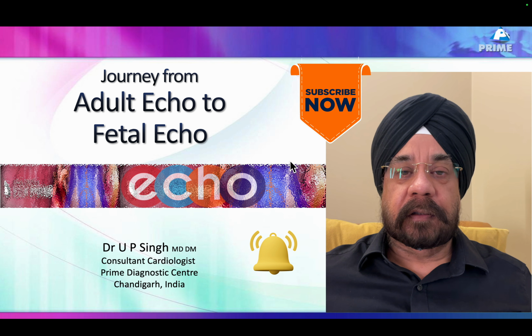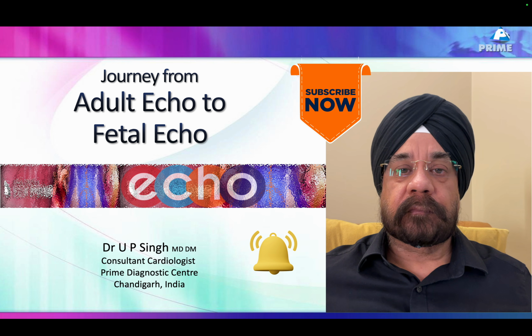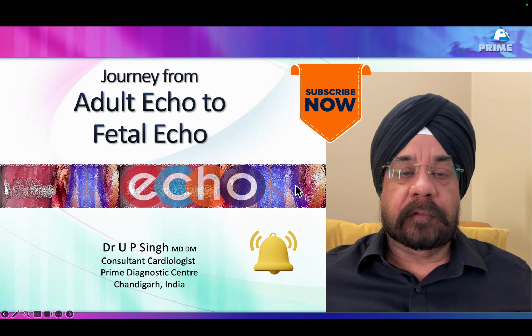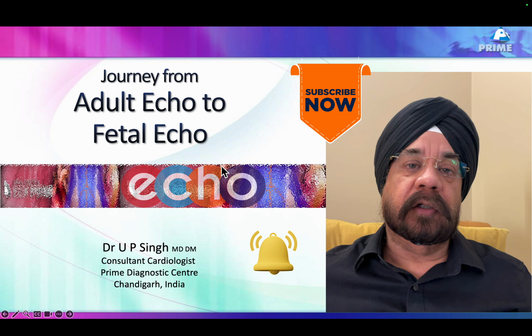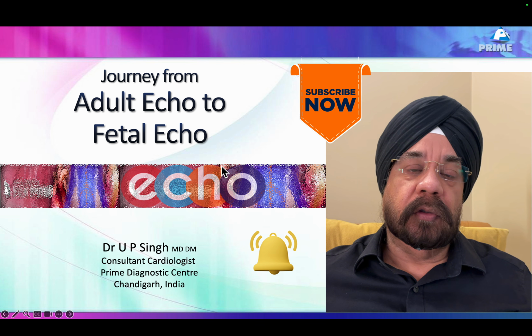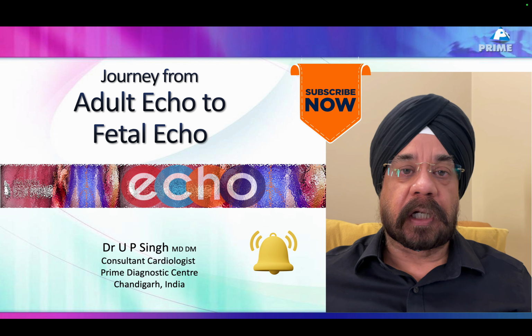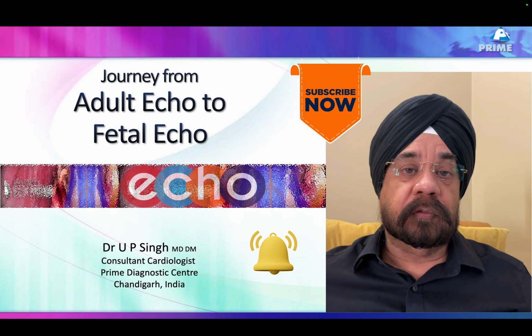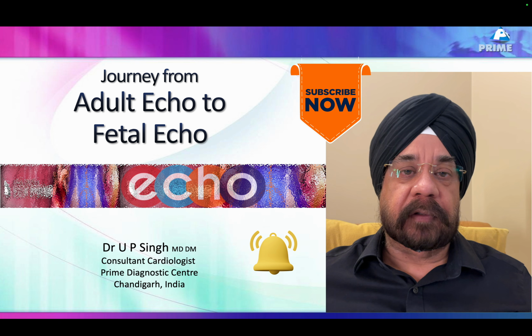Let me take you through a new area of a fetal echo. This talk is meant for adult cardiologists, those who want to do a fetal echo or are beginning to do a fetal echo, what they should know about it. But certainly this can be viewed by radiologists or sonologists, those who want to start fetal echo. I just want to tell you what are the differences between adult echo and a fetal echo. Both are entirely different fields.